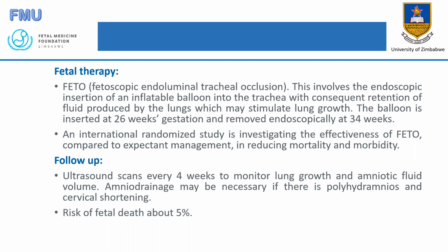Compression of the lungs by the abdominal contents will cause the lungs not to grow because they are compressed. But if the balloon is put inside and the lungs hyperinflate, this will allow the lungs to grow and give the baby a fighting chance after birth to be able to breathe. So this is how it works.